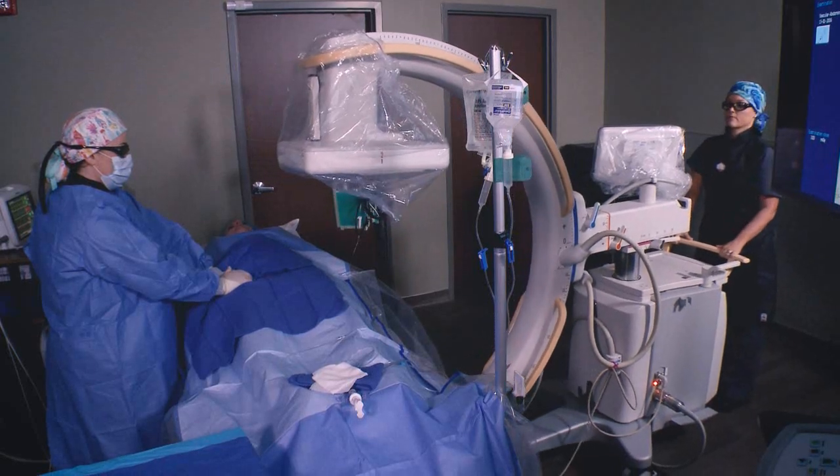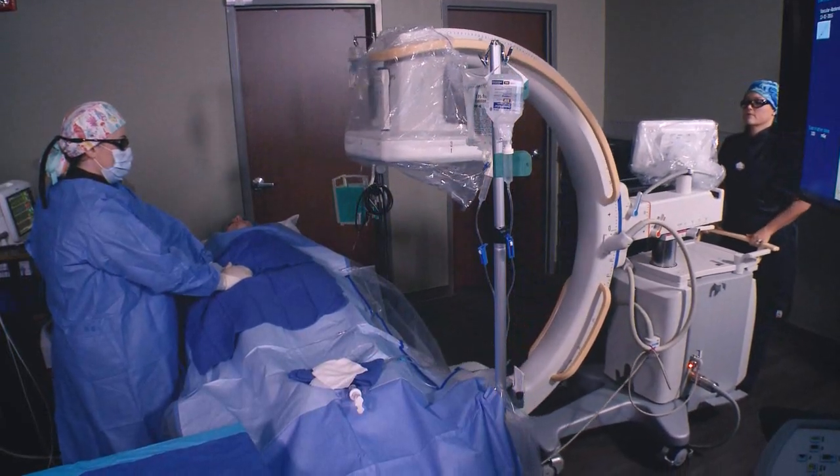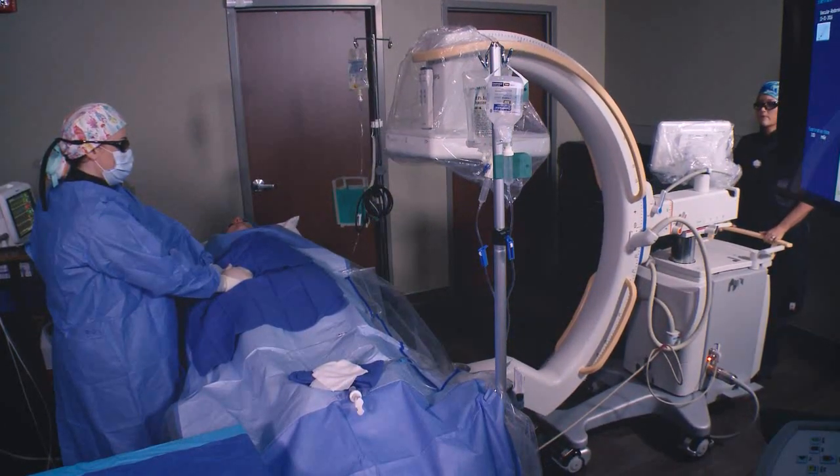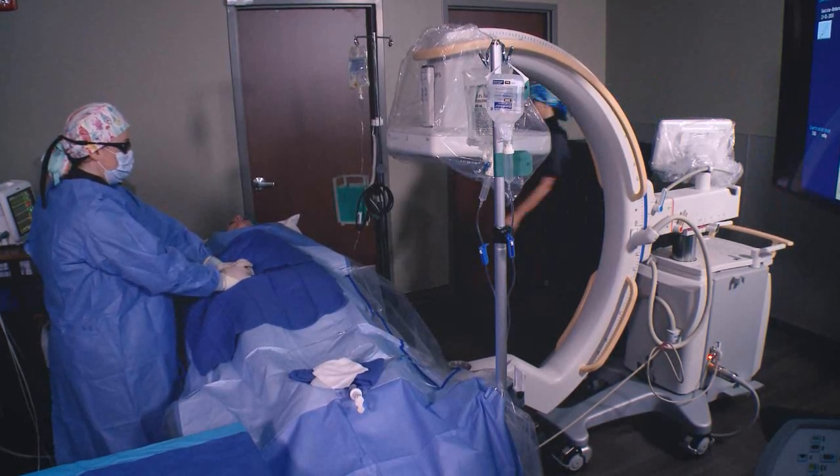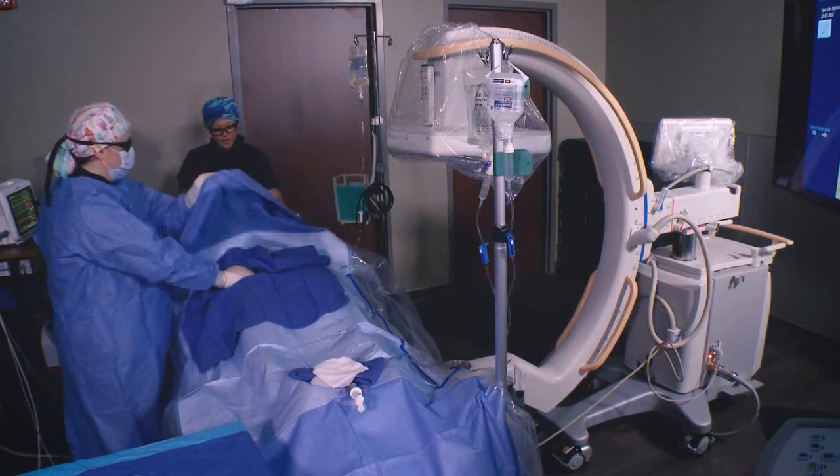At the end of the case, we are able to, with a single user, remove the C-Arm out of the way, get the patient off the table in an expeditious manner, then export the information to our PAC system and into our EMR very easily.